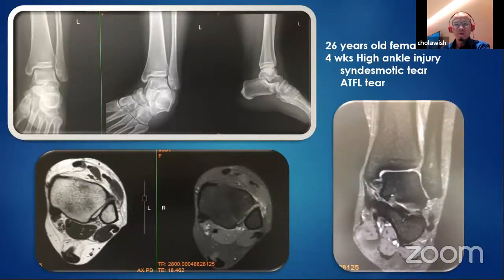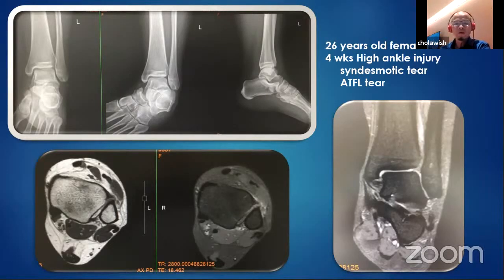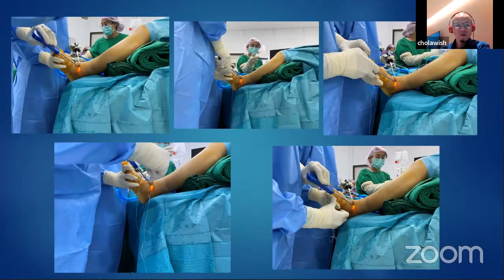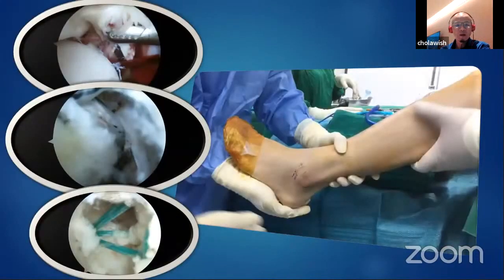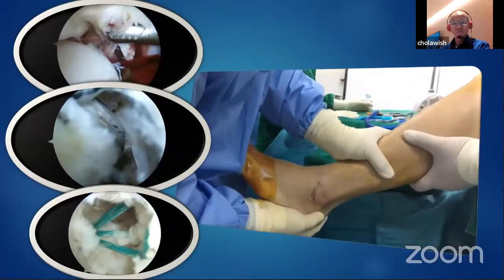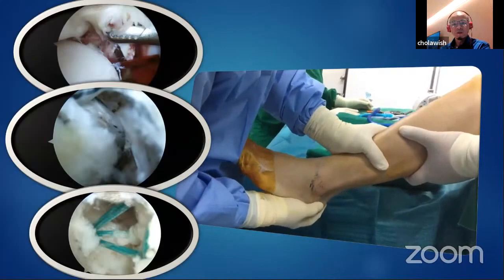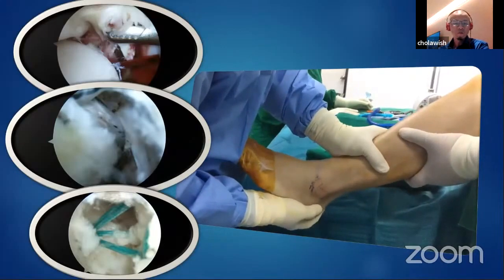Another case: a 26-year-old female with four weeks of high ankle injury. We documented a syndesmotic tear and also ATFL tear. We decided to perform arthroscopic syndesmotic repair and arthroscopic modified Brostrom. The results show the ankle is quite stable.